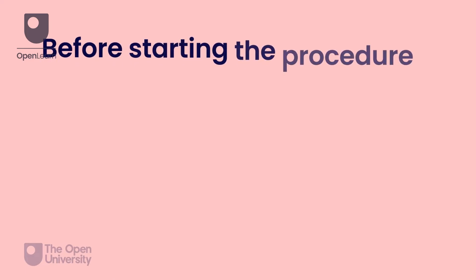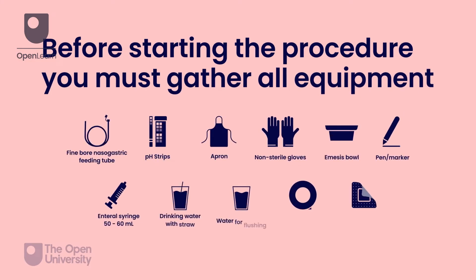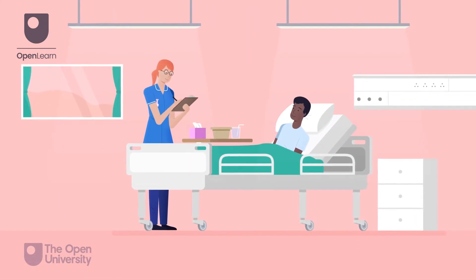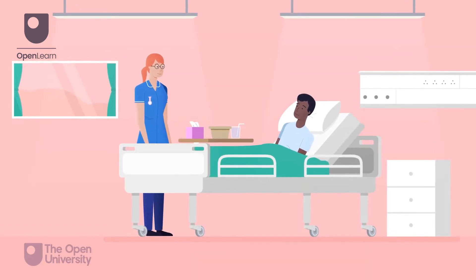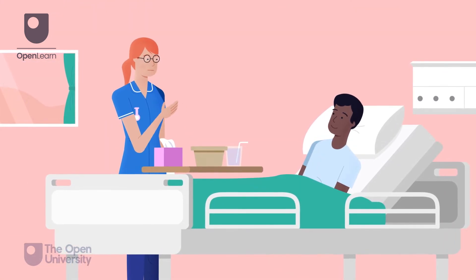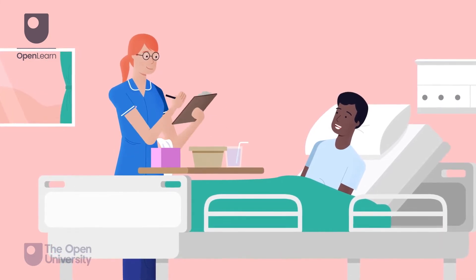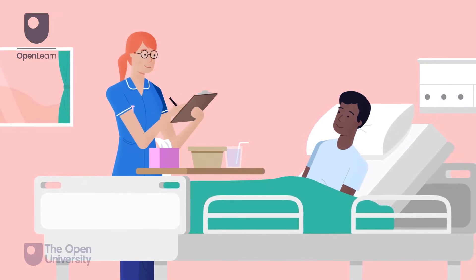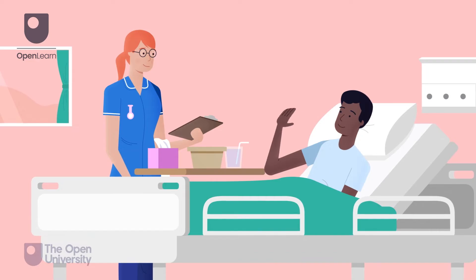Before starting the procedure, you must gather all equipment. Check local policies and procedures for the brands used in your practice area. Assess the needs of the person and identify any contraindications to the procedure. You must explain the procedure to the person in clear, accessible language and obtain their informed consent. Document this process. Agree on a sign to enable the person to stop the procedure if needed.